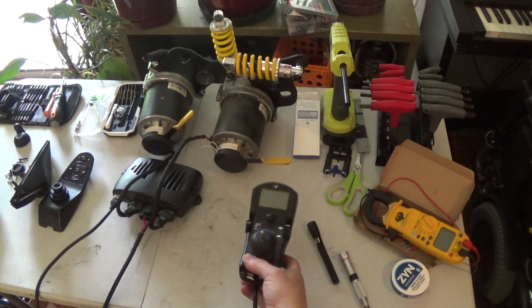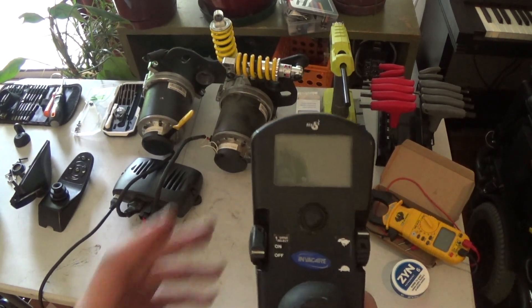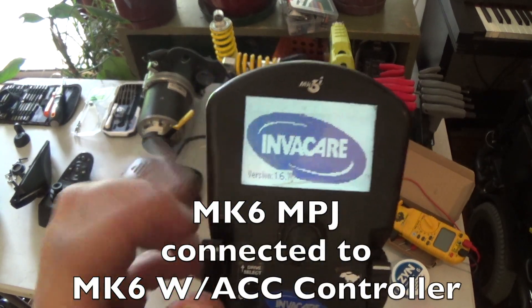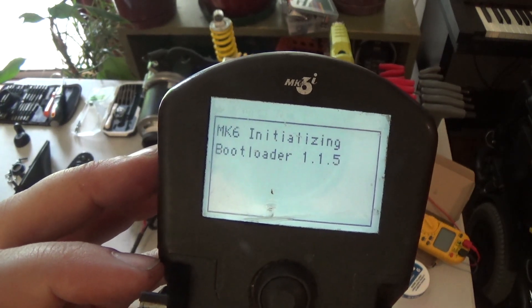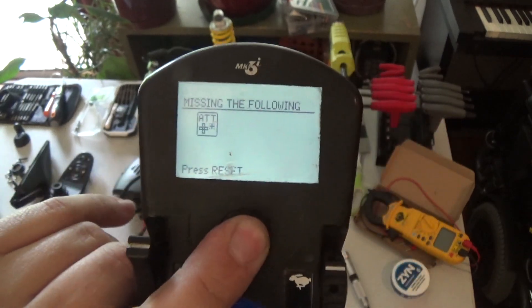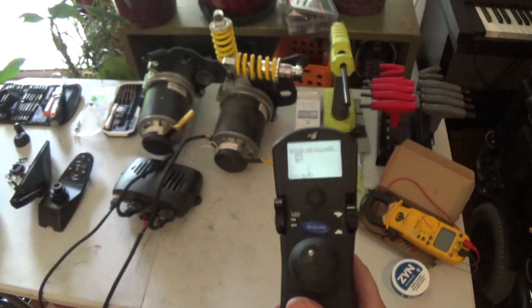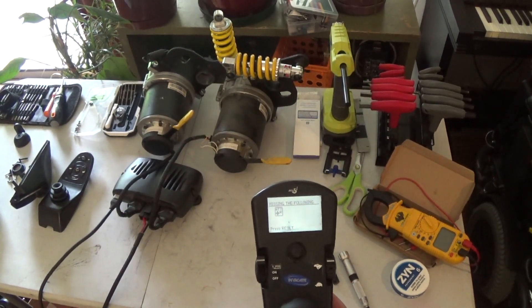Just to clarify — the control inhibited error was a programming issue, not a compatibility problem, so in theory the grayscale one should work. But we're getting missing press reset, so this test may not be very conclusive.